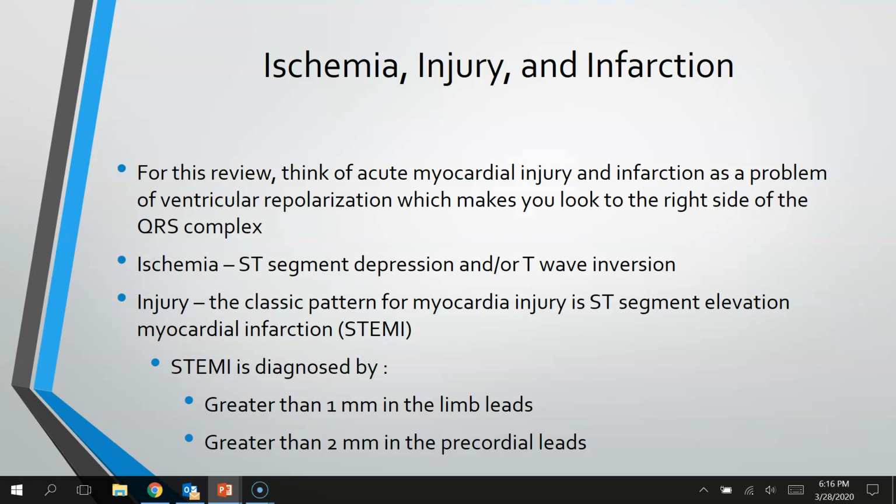There's an elevation. When a STEMI's coming in, once they hit the door, they have to hit the cath lab within a certain amount of time to hopefully help prevent any type of permanent damage to the heart. A STEMI is diagnosed by greater than 1 millimeter increase in the limb leads or greater than 2 millimeters in the precordial leads.